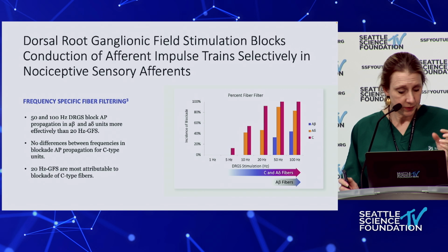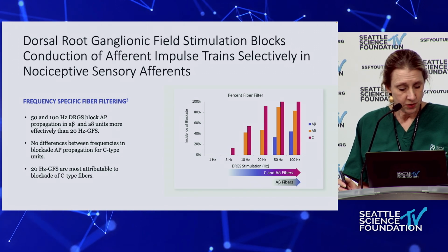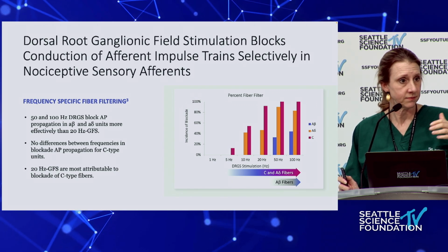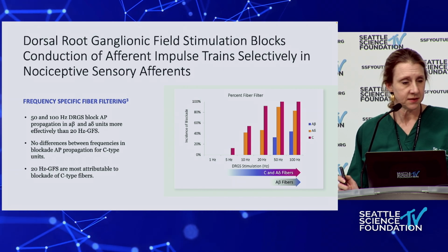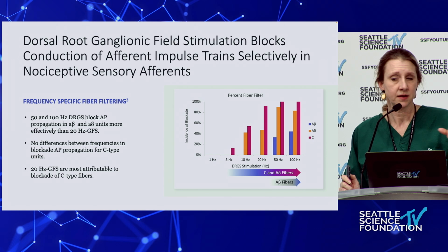The stimulation frequencies are between 50 and 100 hertz. So these are, on the DRG, subthreshold frequencies of stimulation for most patients. And within that range, there is no difference. It's a very patient selective assignment.